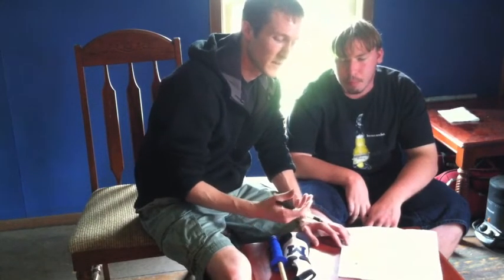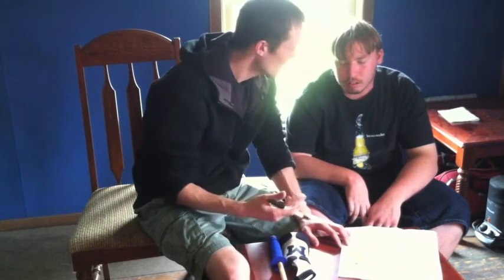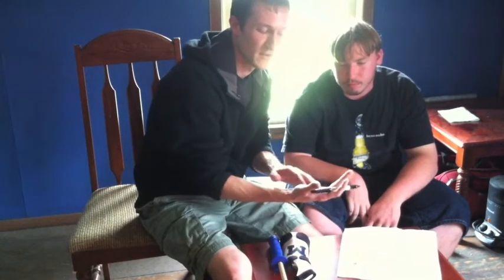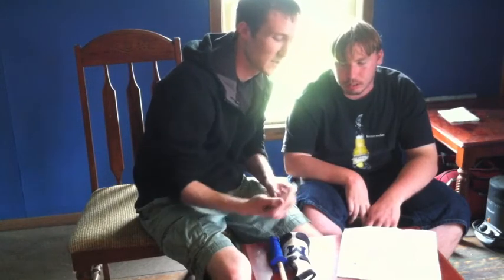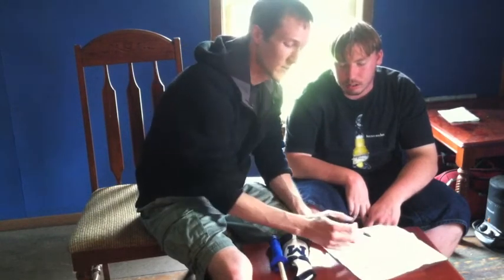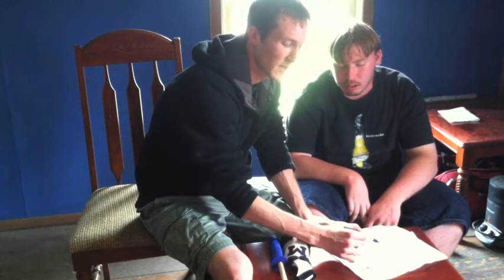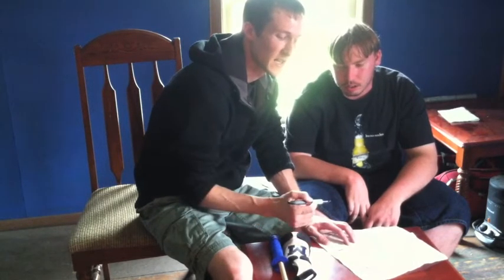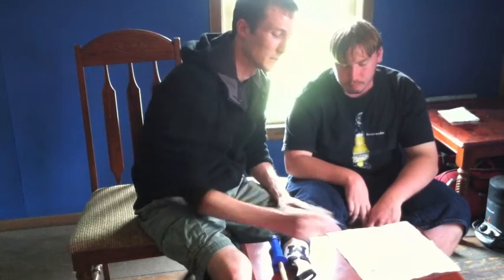So this custom orthotic, or splint, is going to be custom made for Nick's hand. That's what the specific measurements are for, so we can gauge where his different arches are in his hand, and the creases, etc. So then I'm going to take the spot where I made the first MP joint, go a little bit above here to create some extra room, and draw a line over to the last MP joint that I made, and trace my line down here.